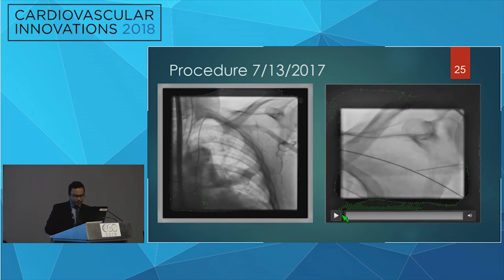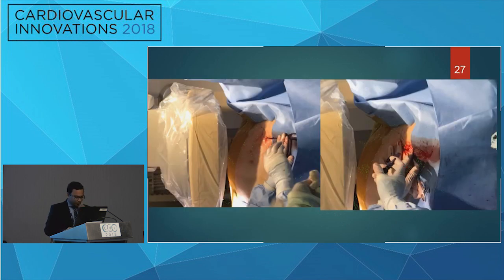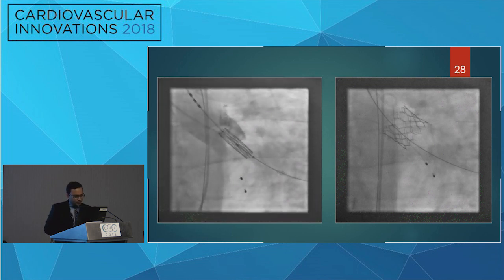There's a micropuncture wire for the safety wire trying to access at the site where we saw. And just the sheath advancement. So this is the team of the surgeons and interventionists doing it. So first we deployed 2 Perclose devices and exchanged with the Safari wire, a standard everyday procedure. And that's our implant angle here.